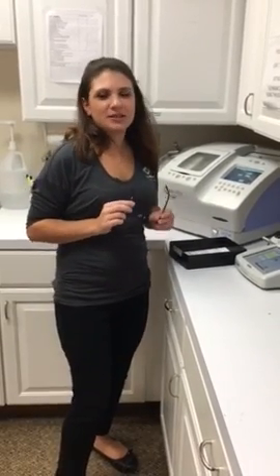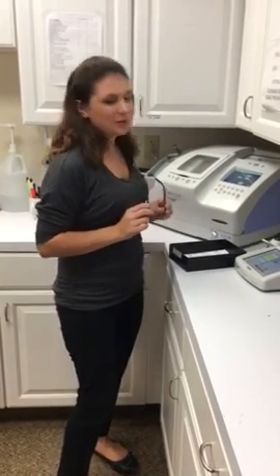Hi, I'm Rachel Stearns. I'm the lab manager here at Broadview Eye Center, and I'm going to show you how to edge lenses.